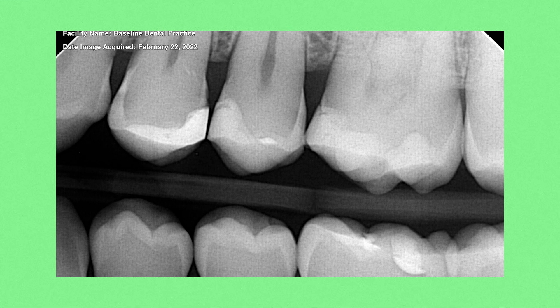Here are the patient's x-rays before we drill on the teeth. These two teeth have three cavities and one void in a previous filling, which we will be fixing by doing four separate fillings on these two teeth.